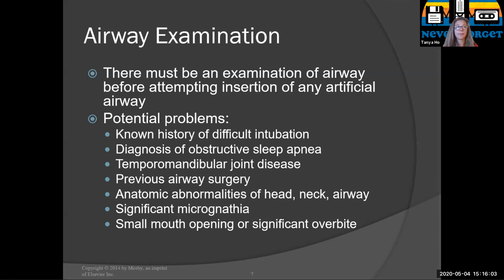Anything like that means that they had a difficult time getting the tube in. If they have a history of a difficult intubation, it's likely that they will be difficult again. So wherever possible, this is where you would gather additional information to make sure that if you get into this scenario, you have everything you need right there and it is a disaster averted.